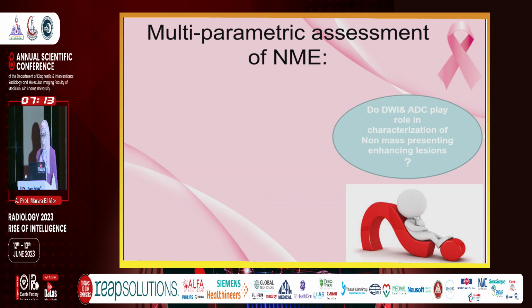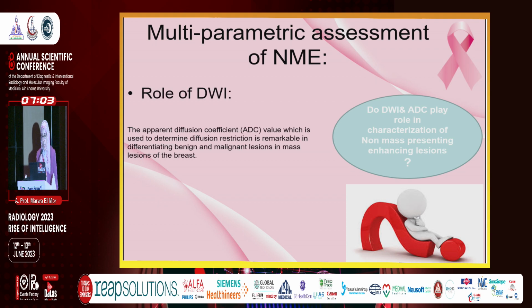We come to the multiparametric assessment of non-mass enhancement. First, we will start with diffusion. Do diffusion and ADC play a role in characterization of non-mass enhancing lesions? The ADC value, which is used to determine diffusion restriction, is remarkable in differentiating benign and malignant lesions in mass lesions of the breast. However, previous studies report that the same cannot be said for non-mass enhancing lesions.